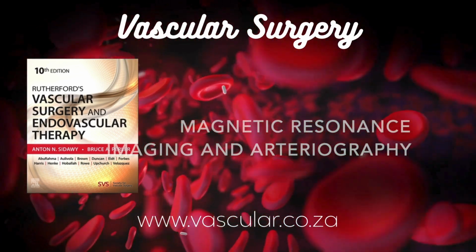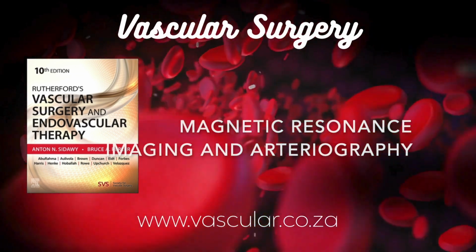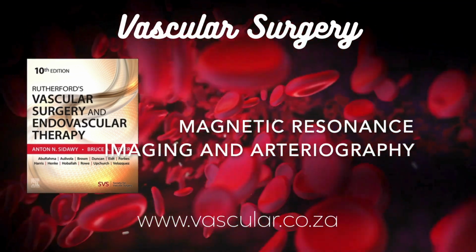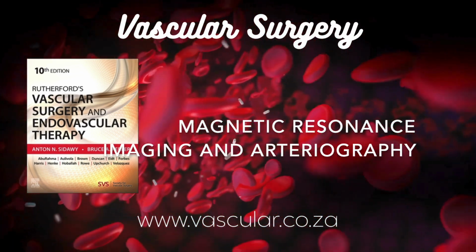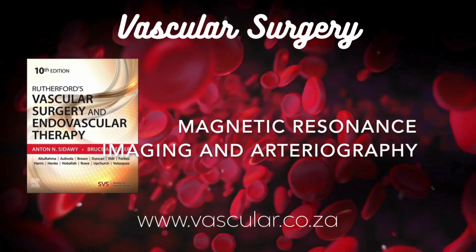That's right. Those are two main families of pulse sequences. Spin echo sequences often rely primarily on RF pulses to create contrast, and they're commonly used for generating those standard T1 and T2 weighted images for general anatomy and pathology. Okay. Gradient echo sequences, on the other hand, use both RF pulses and gradient switching to generate the signal. They tend to be faster.